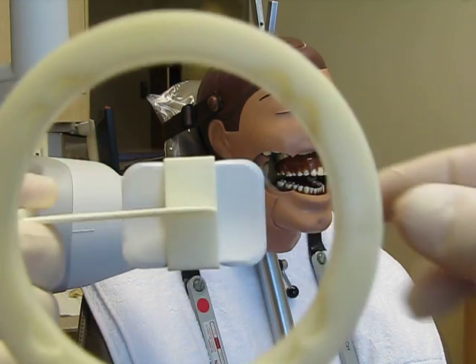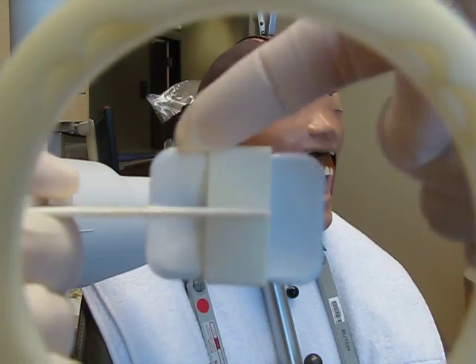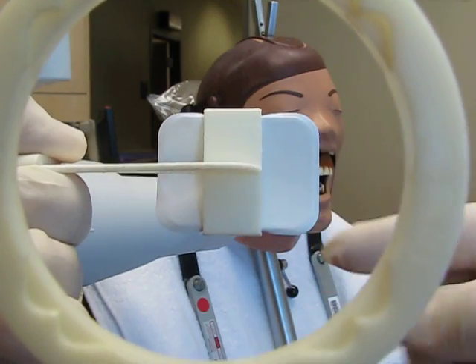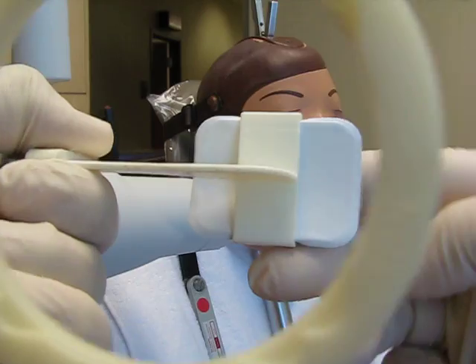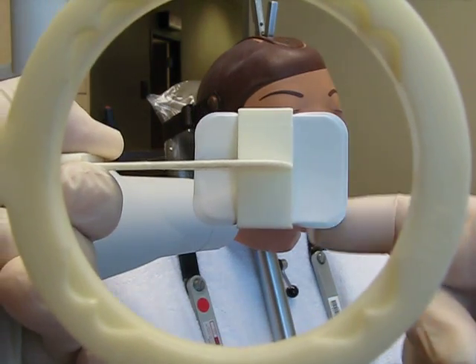Okay, for bite wings that we're going to be centered on premolar, you want to have the film even, equal distance, okay? If you were going to do the molars, then you would do a slight extension. See, it's no longer equal. Slight extension towards where it was going. So this would be the distal, where the molars are. So the slight extension would be in the back, okay?